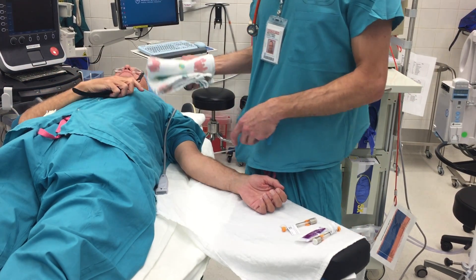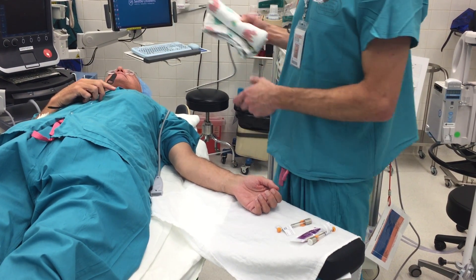I have a bolster to put underneath his arm, and I have some tape.